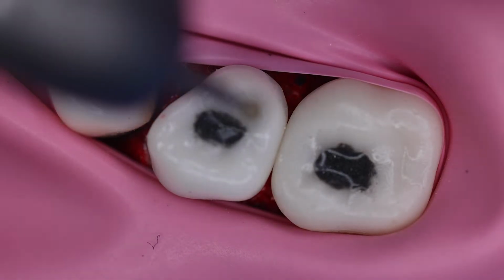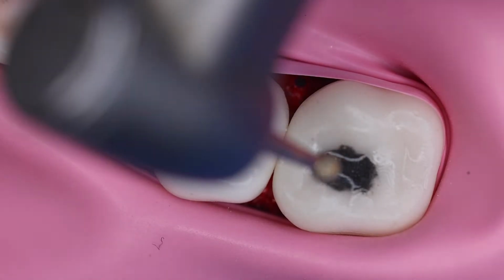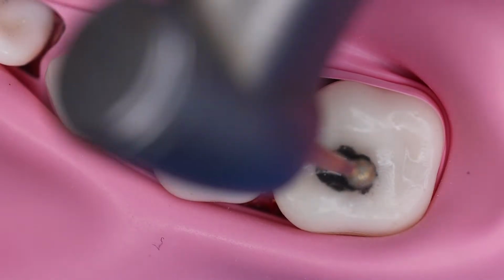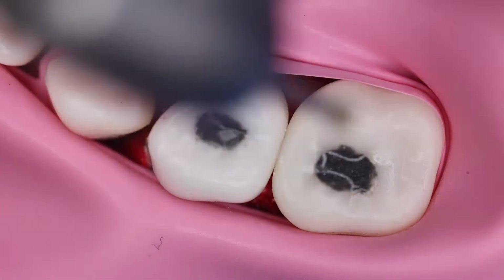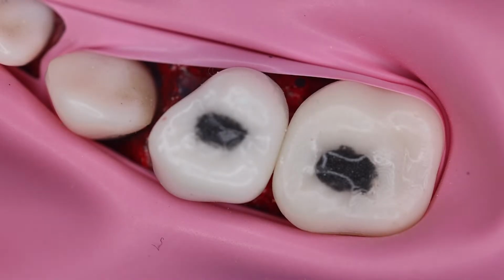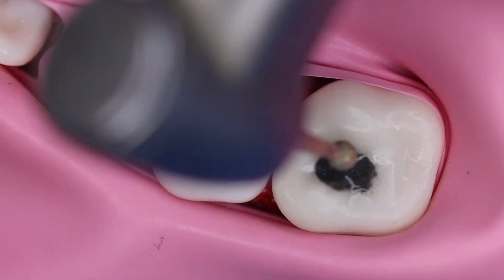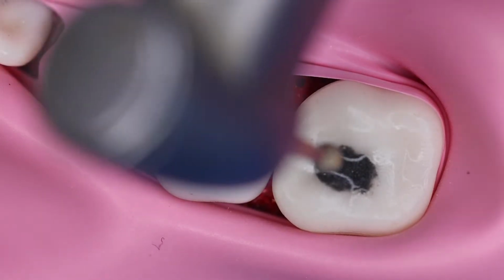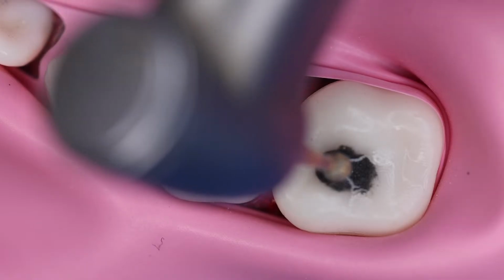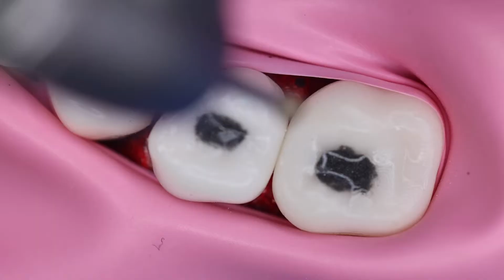So first, we should be removing this carious lesion with a round diamond point. We are following a method of excavate and evaluate when we don't have a radiograph, and there are no clinical signs or symptoms except the clinical appearance of caries.